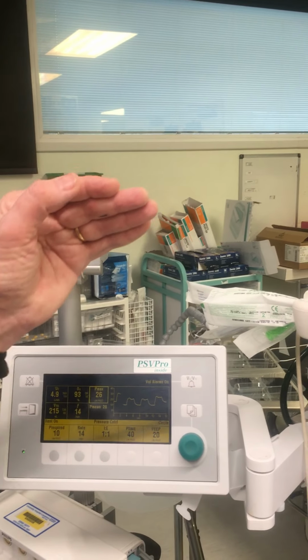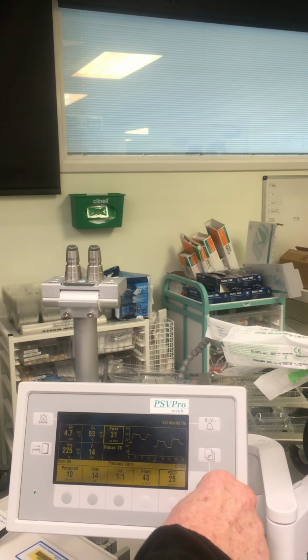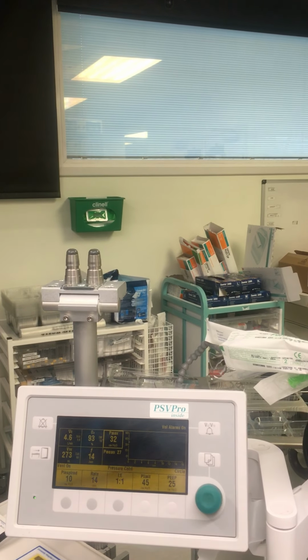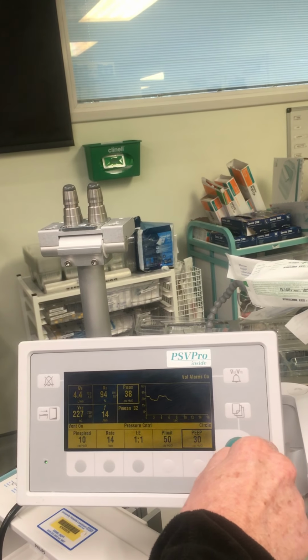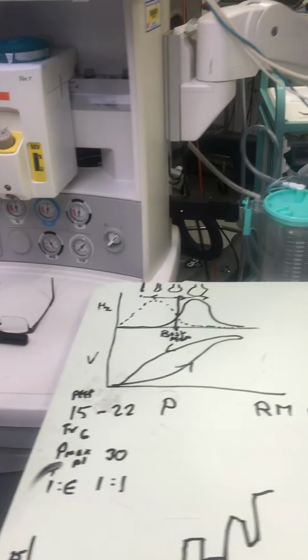So I'm just going to keep going with that. It's going to alarm in a moment. How long are you leaving it in between each? 2 or 3 breaths. And I'm just going to keep going until I lose my bottle.